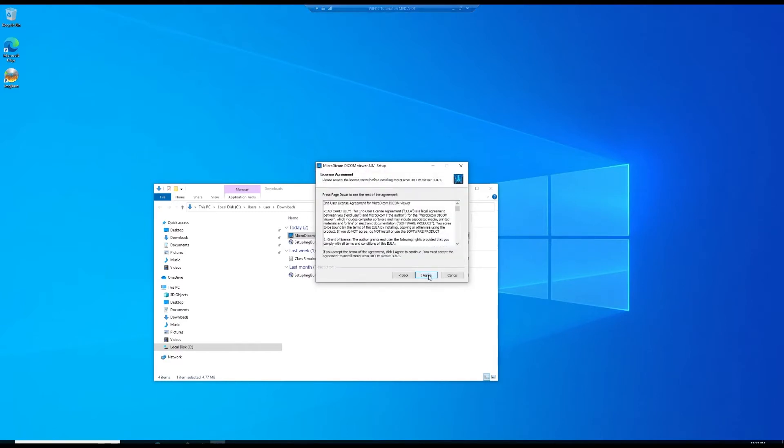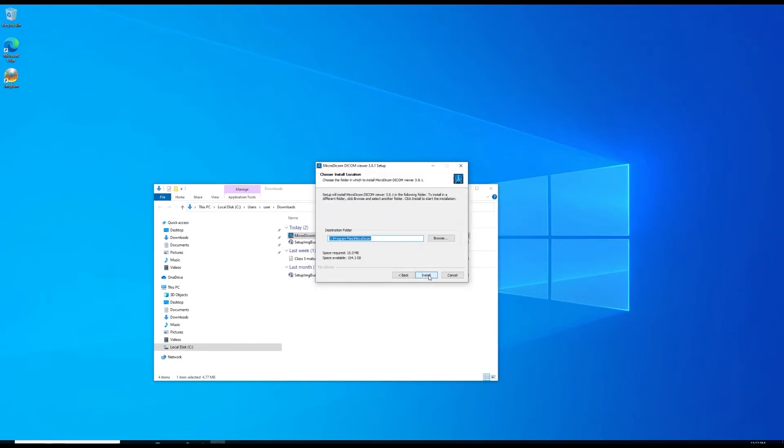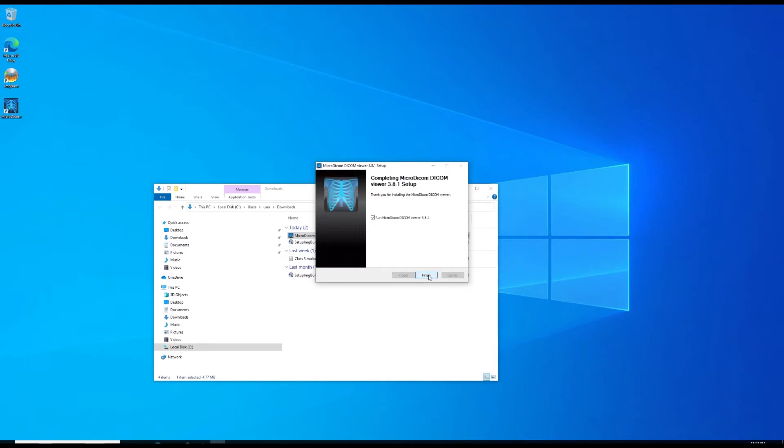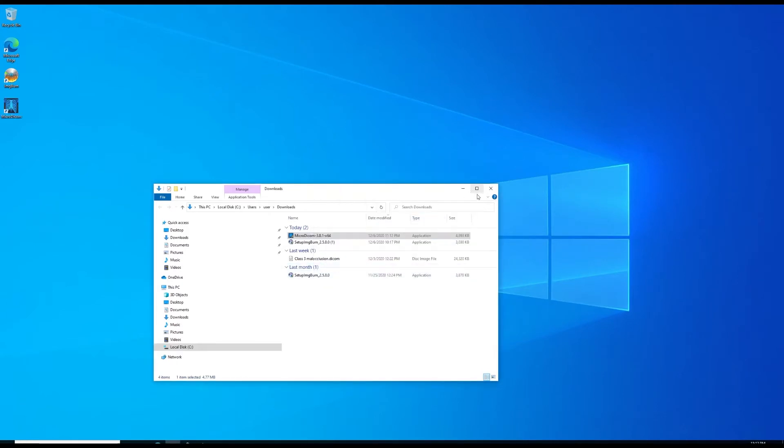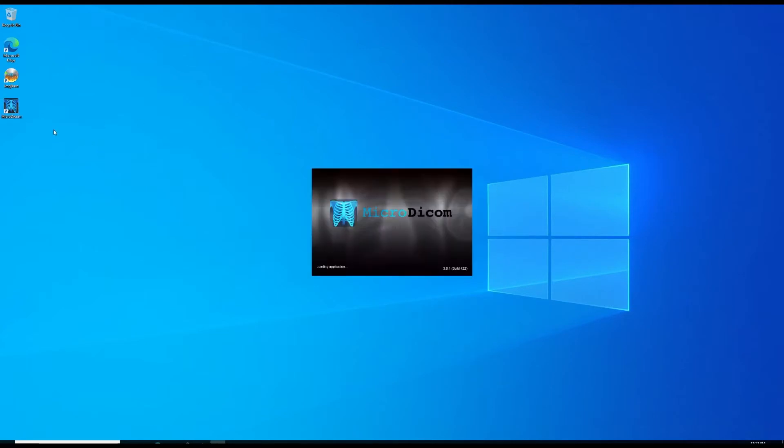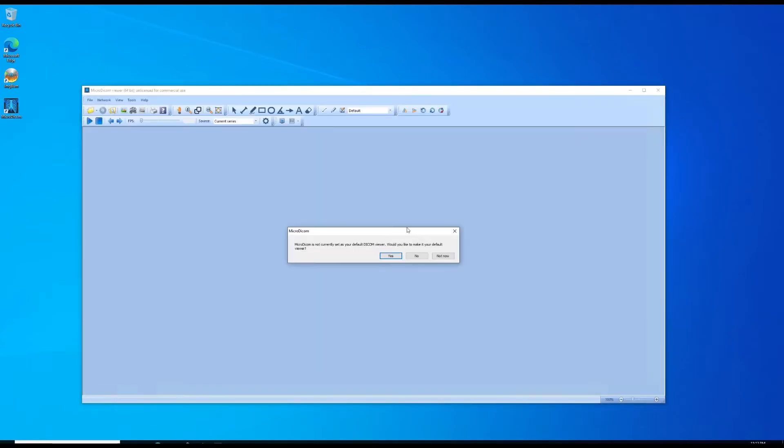We're going to hit next and run through the installer. You may already have MicroDICOM installed. Click finish. We don't want to run it yet. First we're going to mount our ISO image, or if you have a CD you can just put that CD in the drive.